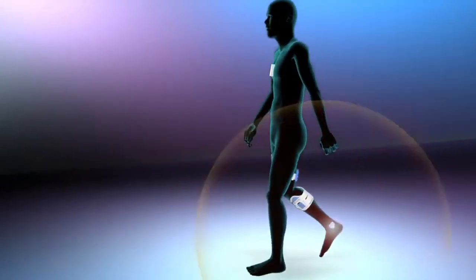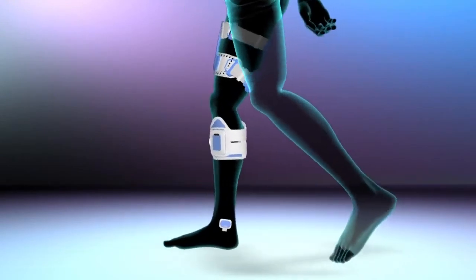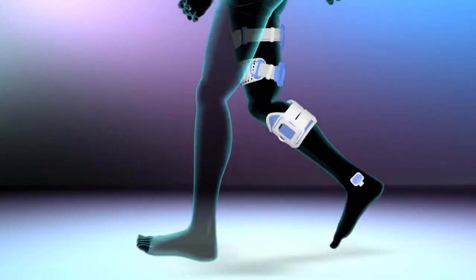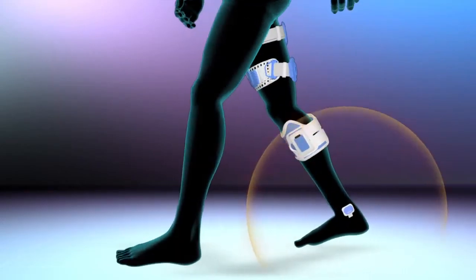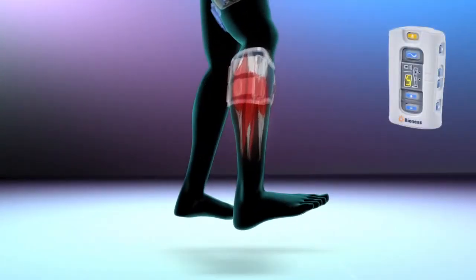While walking, the patented gait sensor detects the position of the foot and transmits wireless signals to synchronize the electrical pulses delivered by the stimulation units on the leg and thigh cuff. The pulses from the leg cuff activate the nerves, stimulating the muscles that cause the foot to lift off the ground at the appropriate time during gait.